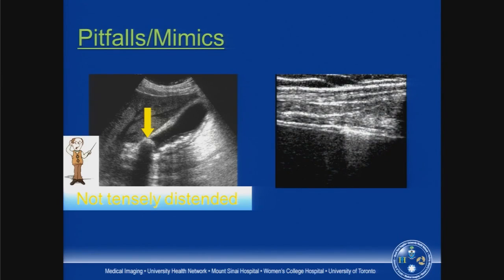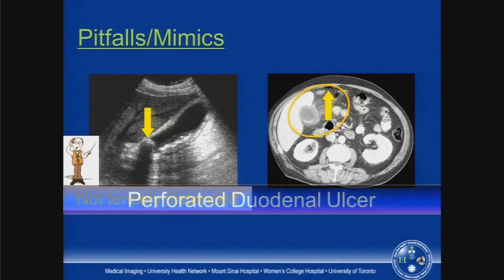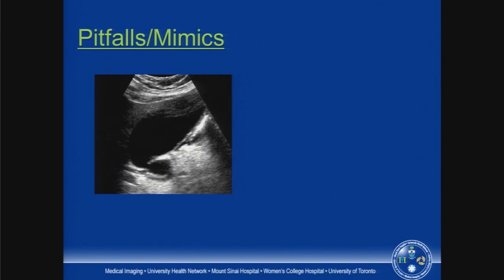And when we rolled this patient left posterior oblique and looked very carefully in the right upper quadrant, we can see this focal enhancement of the peritoneal stripe with a little bit of dirty shadowing behind, and this is the appearance of free air. And of course, this patient had perforated the duodenal ulcer, and there is lots of inflammation in the right upper quadrant, which also involves the gallbladder, but there's also free air. So here the gallbladder is secondarily inflamed from a perforated duodenal ulcer.